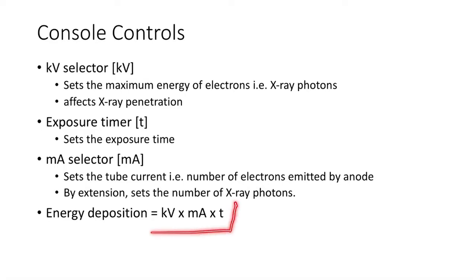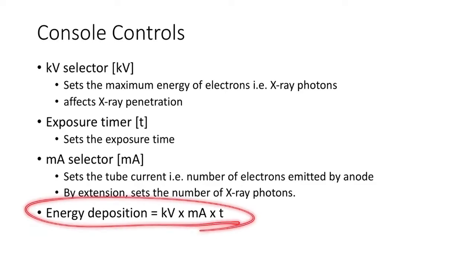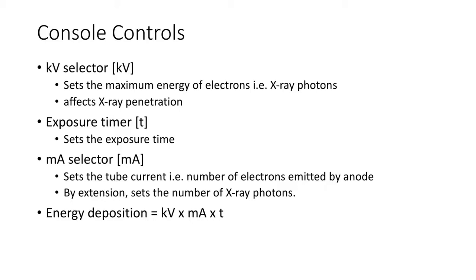This is where we can figure out whether our machine can be used for certain exposures, even before operating the machine. We don't want to overexpose our machine, effectively damaging it. So it's quite an interesting fact that, as I've mentioned earlier, thermodynamics plays a very important role. It comes up also in X-ray tubes.